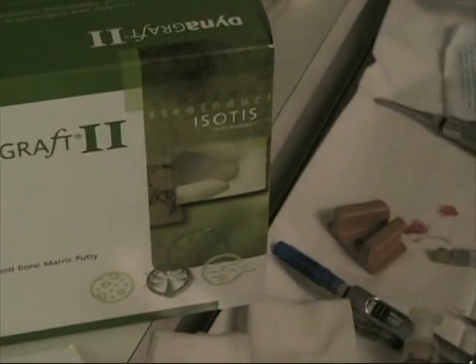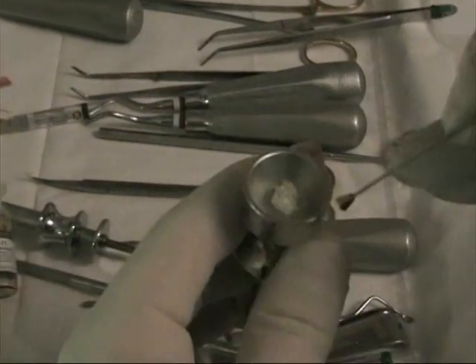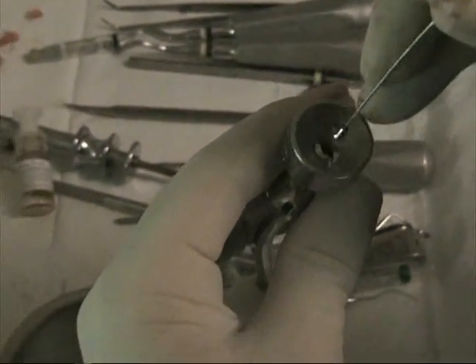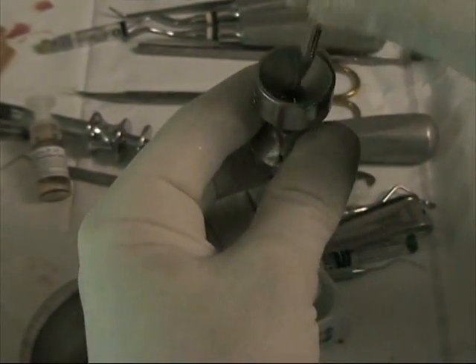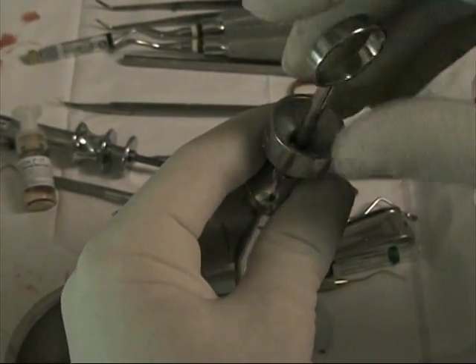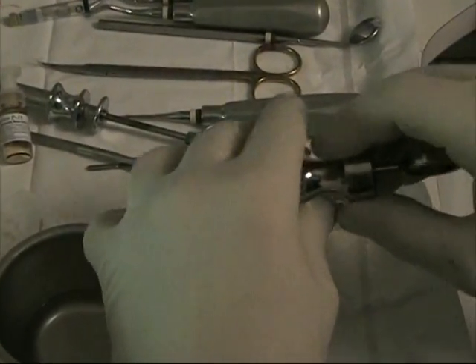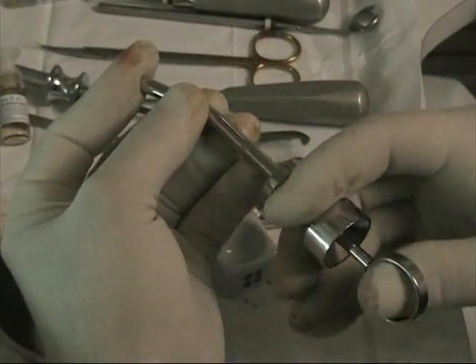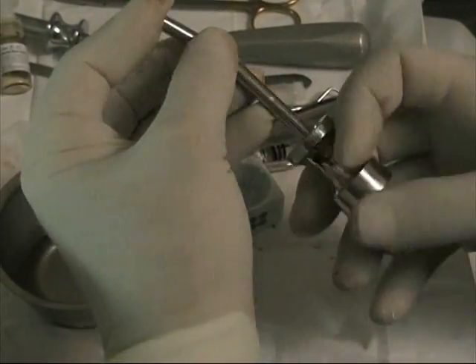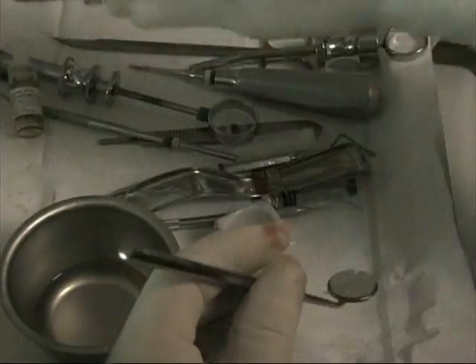I'm using a combination of DynaGraft 2, PepGen 15, and autogenous bone. We've mixed that all together sterilely and we're now placing it in the delivery system. I prefer to have this delivery system as it allows me to use a little hydraulic pressure in placing the material so that it flows where I want it to. So I'm going to put it in the bone injection syringe. I have already treated the area to receive the graft using the process called RAP — Regional Acceleratory Phenomenon — which basically means perforating the cortical plate of the bone and allowing a greater inflow of bone progenitor cells. So that's been done already.